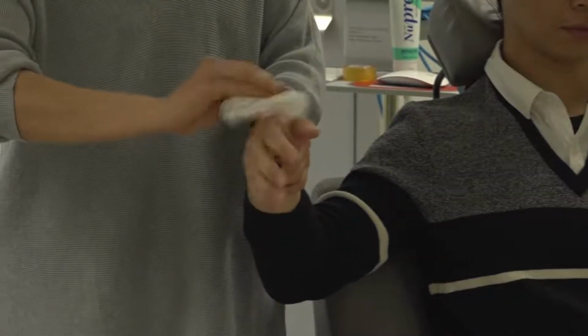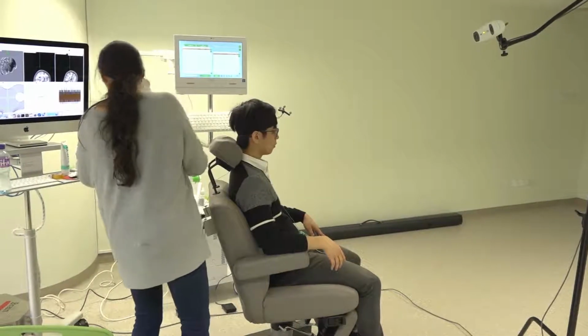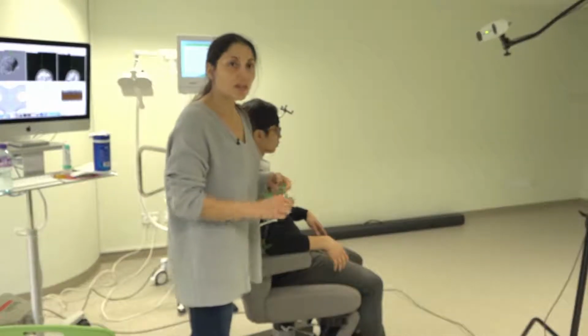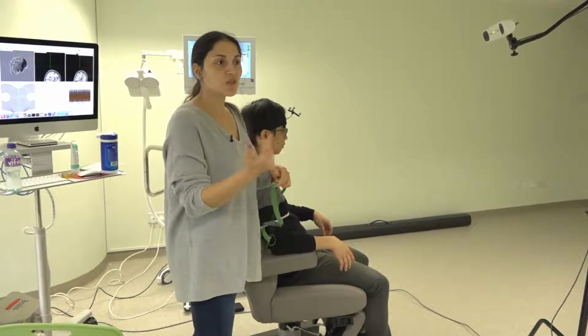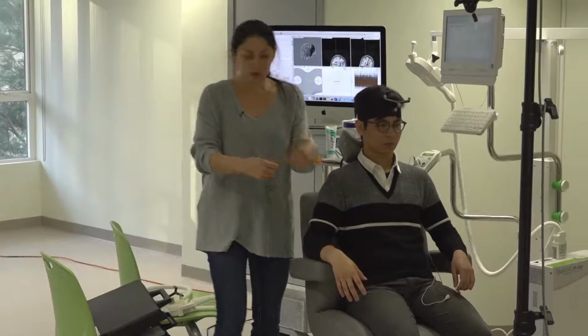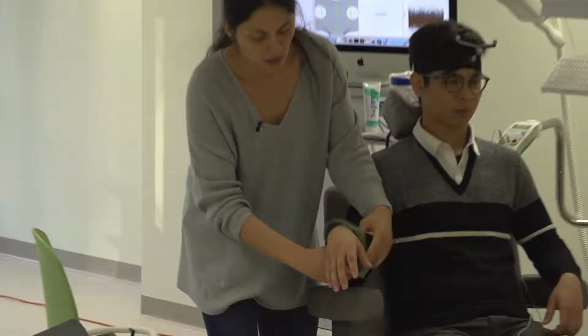Okay, so we have cleaned the area. And you are going to do this tomorrow. So pay attention, because tomorrow each of you, if you want to be certified, each of you needs to show me that you know how to do this. Very simple, right? So you clean the area and then put this thing here, that is the ground.